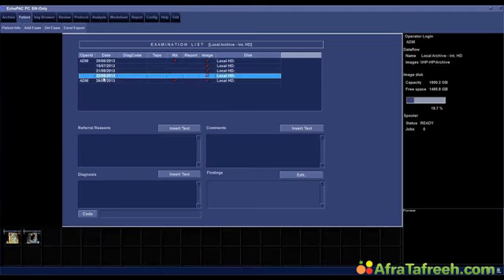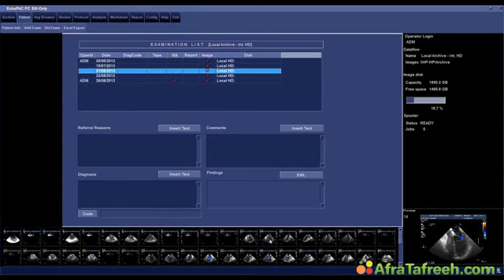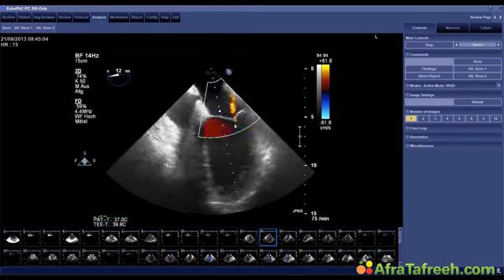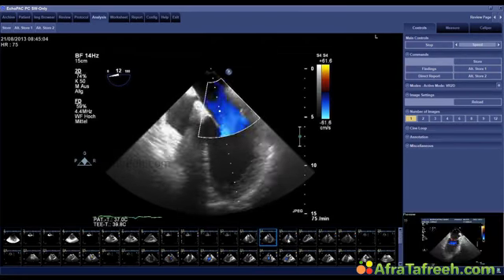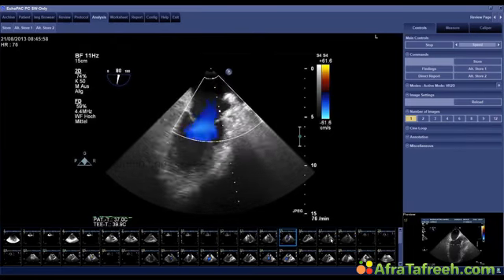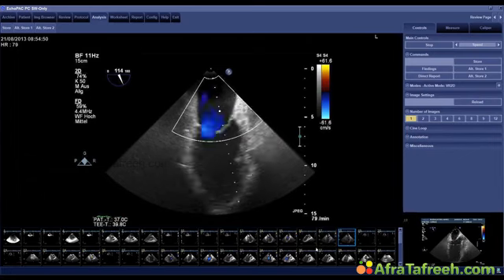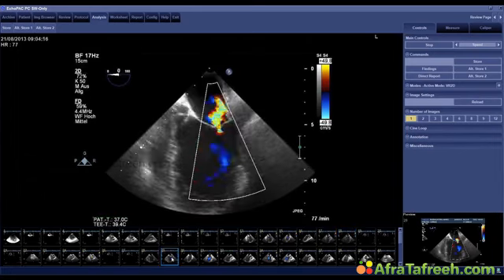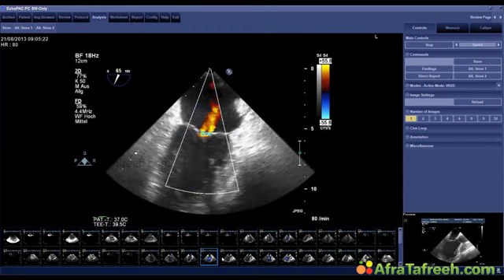Let's go back to the patient. Here we are. So we start out with assessing the valve. Look, regurgitation was almost gone now. I mean, don't let yourself be fooled by this, because we did use provocative maneuvers in the cath lab, and then we did get much more MR. So this is a situation we're confronted with very frequently, that under anesthesia, when afterload and volume is different, regurgitation is less.